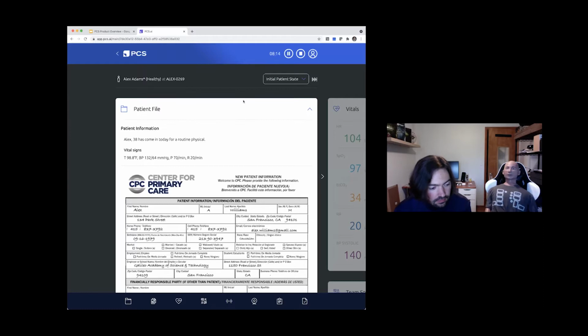The second question is, does the iris cam still have a narrow field of view? Yes, the iris cam is the same camera that has been in ALEX over the past couple of years, so there's no difference there. The same limitations still exist. Is there any reason for that specific field of view being narrow?